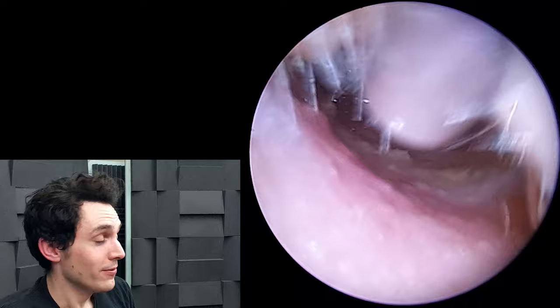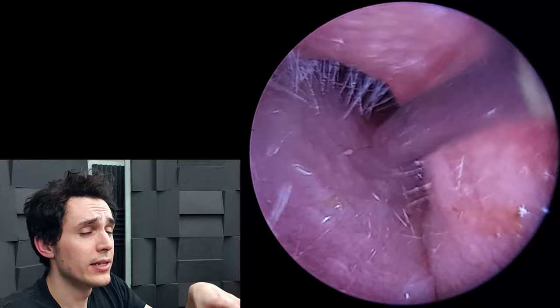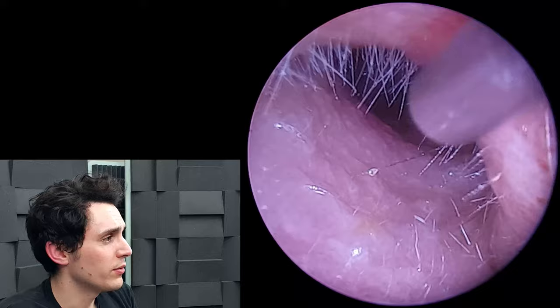I've just applied a lot of olive oil here. What we're dealing with is essentially a huge chunk of wax caught in a recess just before the eardrum — in this particular case it was a very, very deep trench.